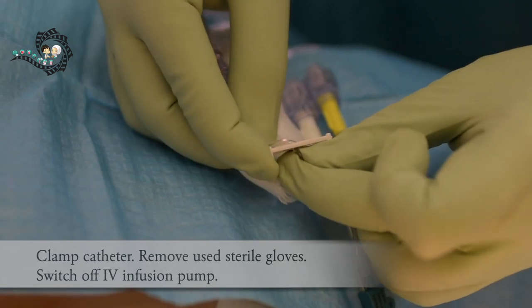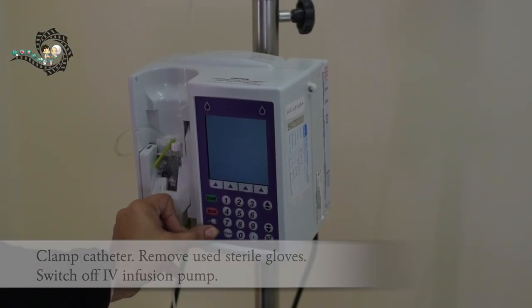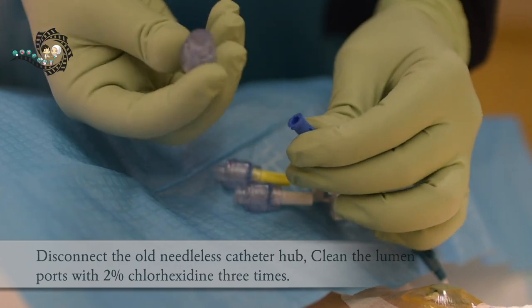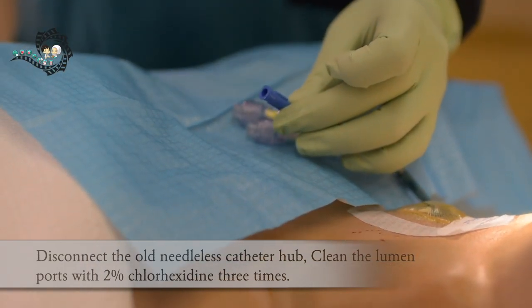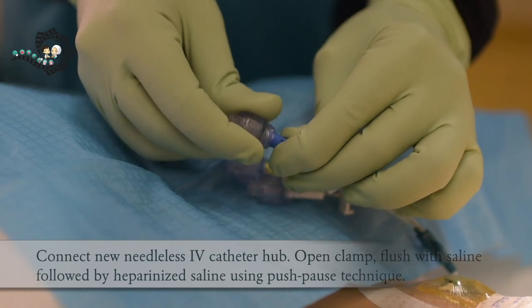Clamp the catheter. Remove used sterile gloves. Switch off the IV infusion pump. Wash hands and apply new sterile gloves. Disconnect the old needleless catheter hub if there is any blood. Clean the lumen port with 2% chlorhexidine in 70% alcohol 3 times. Connect a new needleless catheter hub.